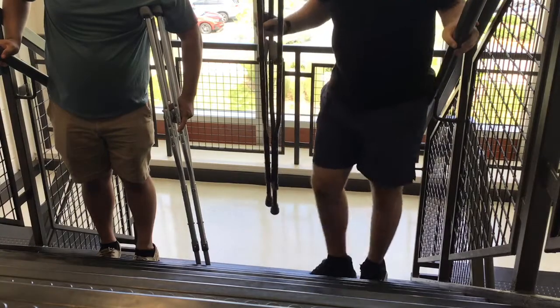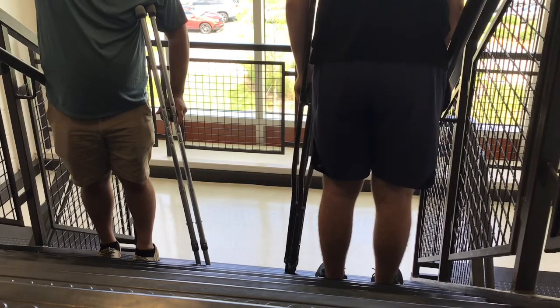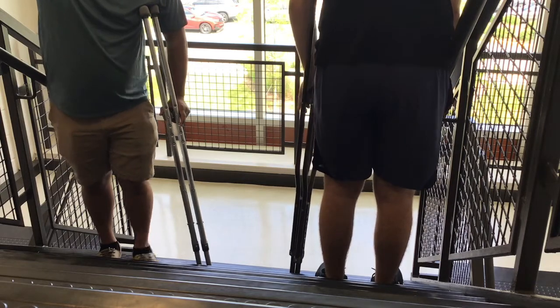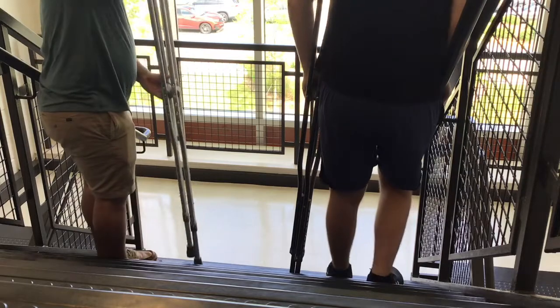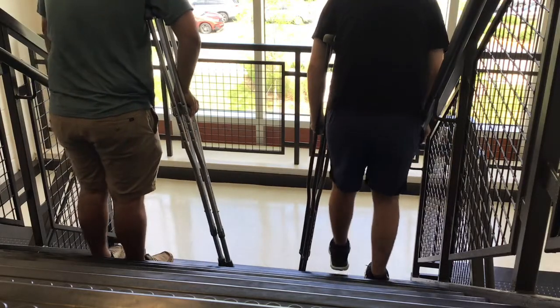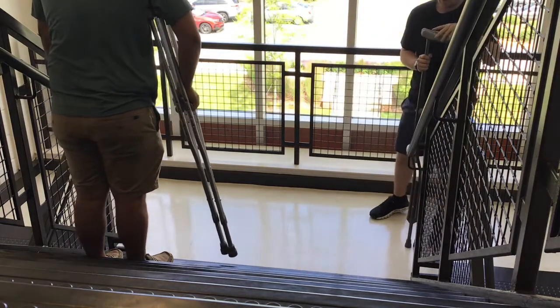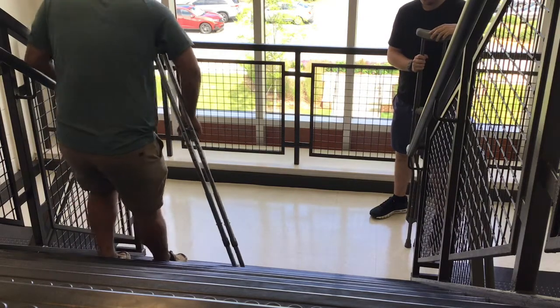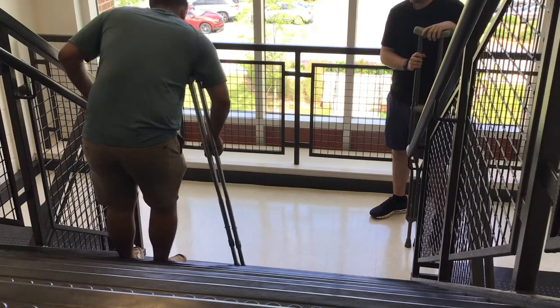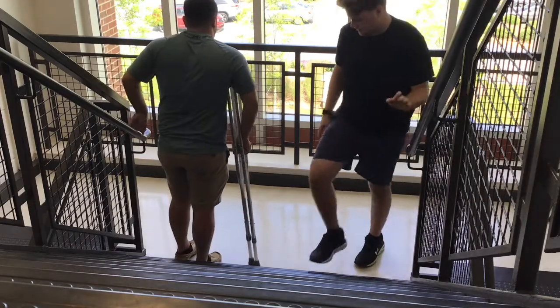So, when you come back down, you will want to, again, crutches on the bad side, arm on the rail, and this time what you're gonna do is put the crutches down on the next stair, and put your injured leg down first. Okay, so it'll be crutches, injured leg, good leg. And you'll just trail down the stairs just like that. Okay. Go ahead. So it's crutches, injured leg, good leg. Alright, that's it.